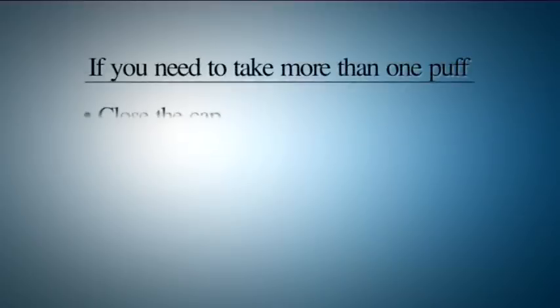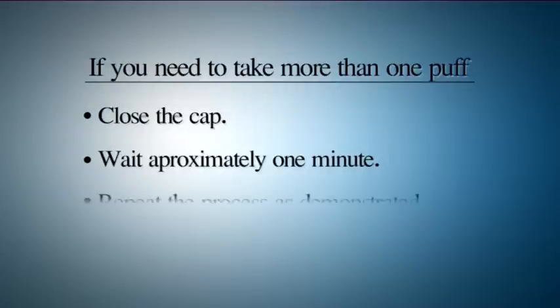If you need to take more than one puff, close the cap, wait about one minute and then start again as demonstrated.